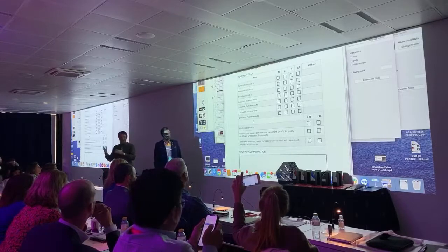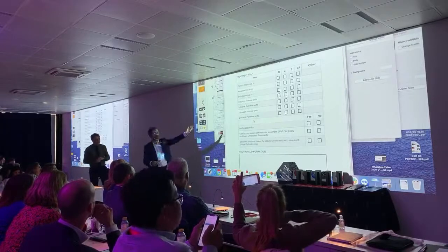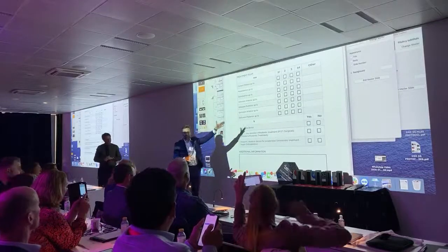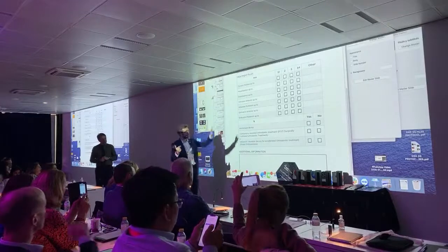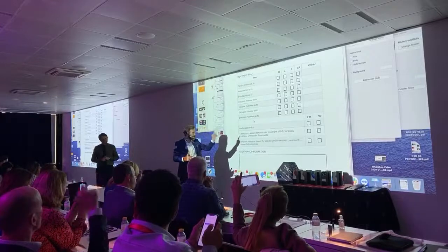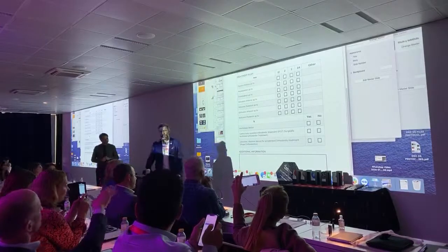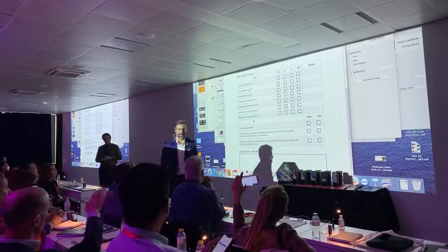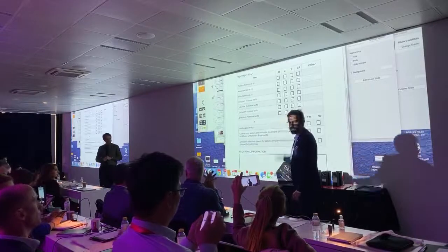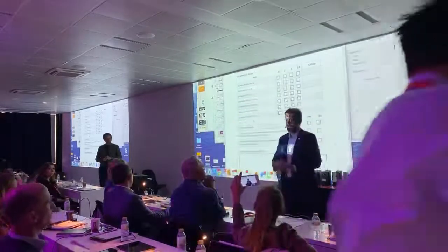Of course, we can change case by case. If there's a specific case where you tell us specific instructions that don't follow this, of course, we're going to follow those. But in general, whatever case reaches us from any one of you, we're going to open this document you sent to us, design the case, and follow this. Okay? So this is new also. We need to show our options, like SFOT, once, until you change any technique. So whatever you change, you can send it again. I sent it again because now I'm using Propel. I'm using SFOT or whatever. Okay?